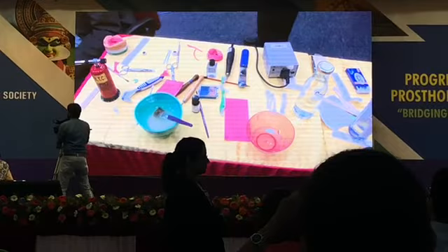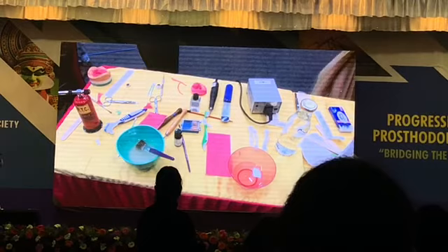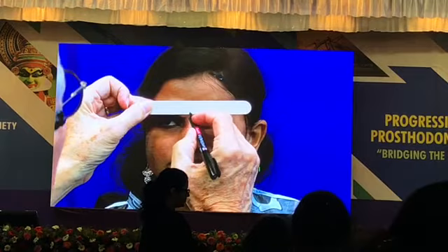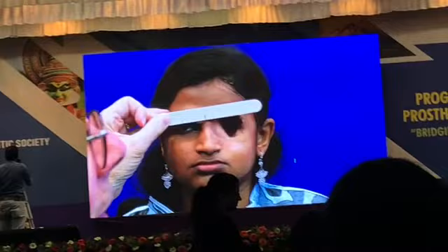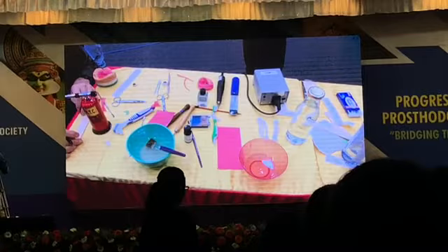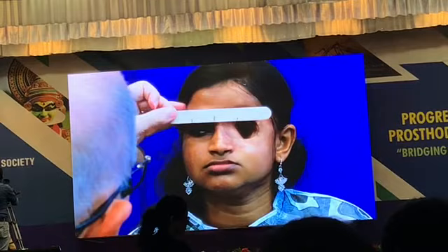Now, the next thing you do, now you can focus on the patient, is you take a tongue blade. You make a mark on the tongue blade, and you put that mark right in the center of the midline, and then you make a mark where you think the pupil is on the right side, and then you make an equivalent mark on the other side. So now you know where the globe is going to go, pretty much.